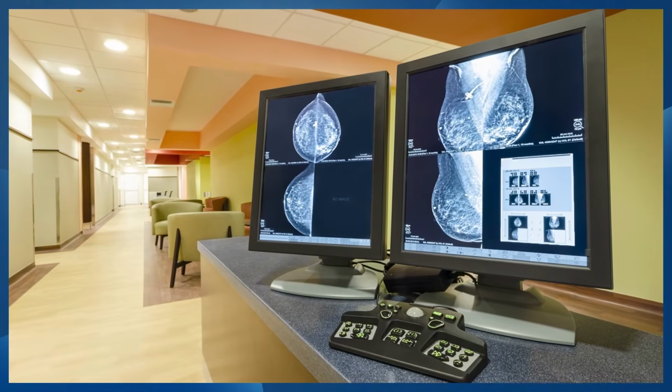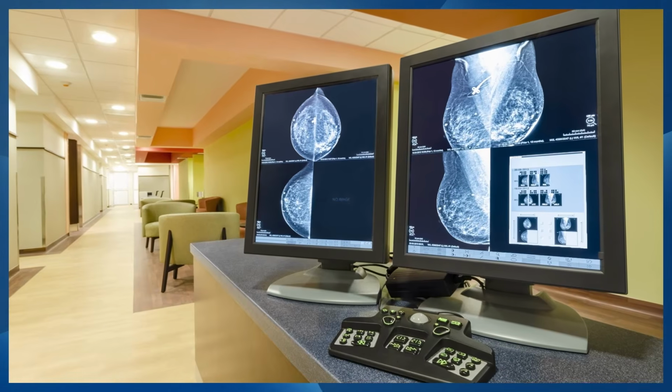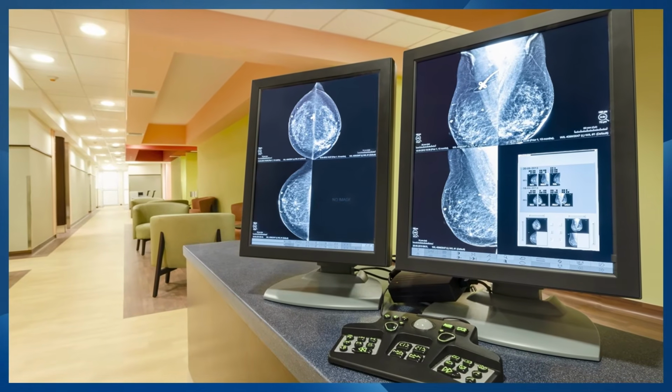So mammography is a very user-dependent modality. BreastScreen have developed a very strict grading system to determine whether an image taken is acceptable or not. The quality assurance and the quality control required of a mammographer is quite high due to the importance of early detection. It's very important to get as much breast tissue as possible on all projections taken. Missing anatomy can lead to missing pathology, which is just detrimental to a patient prognosis.